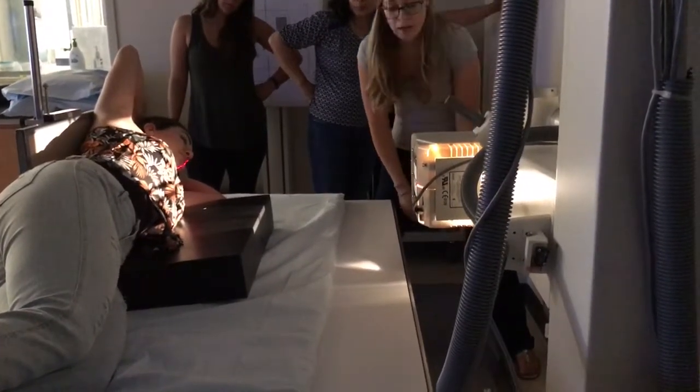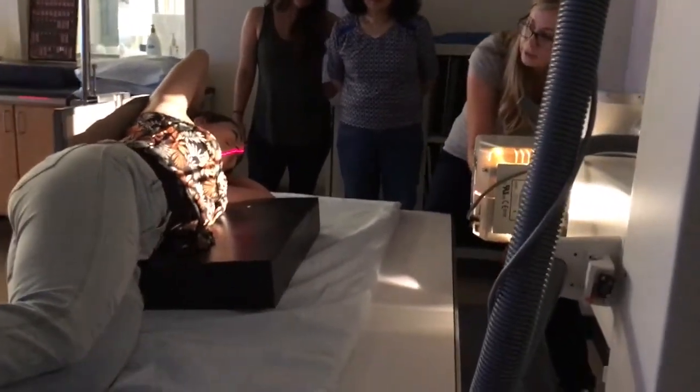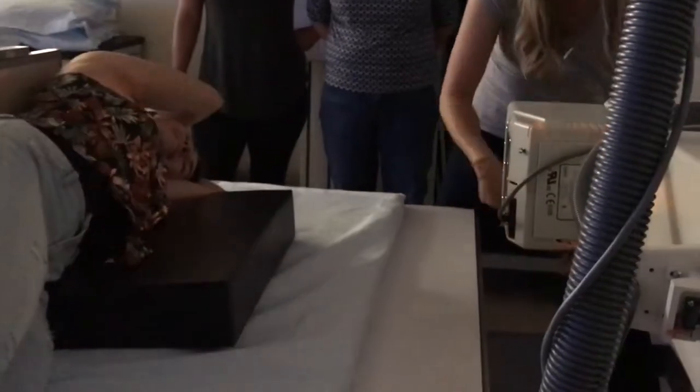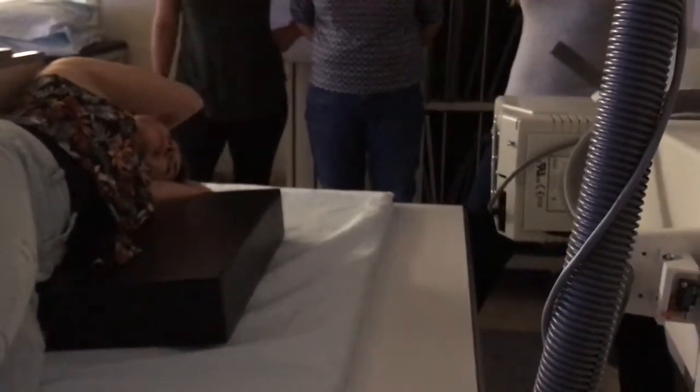She would sit in this position for how long? Five minutes. Five minutes. You can make yourself comfortable. So five minutes just like this.